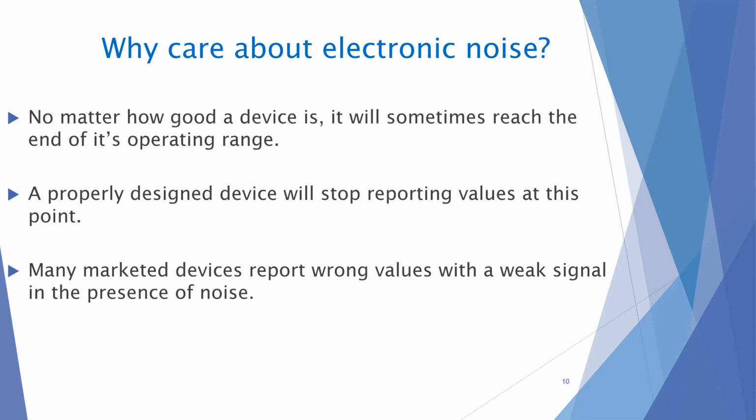And the thing that it picks up as the arterial SAT is noise. This happens very infrequently.